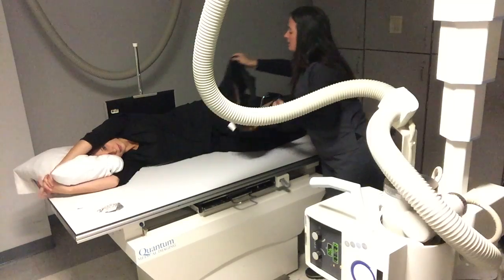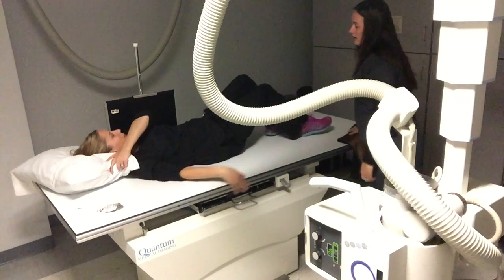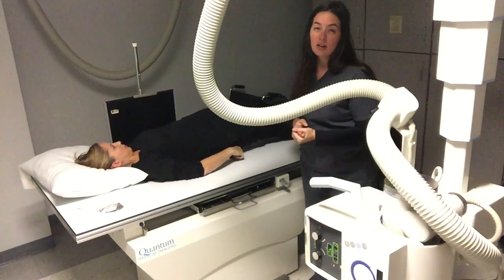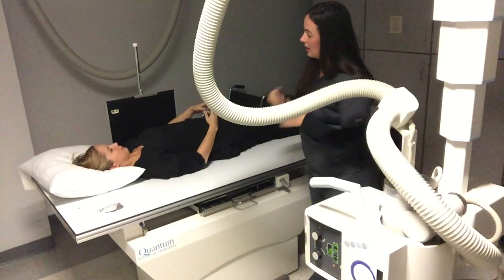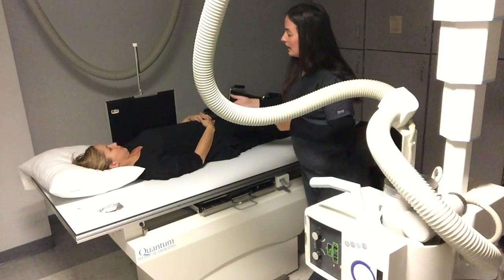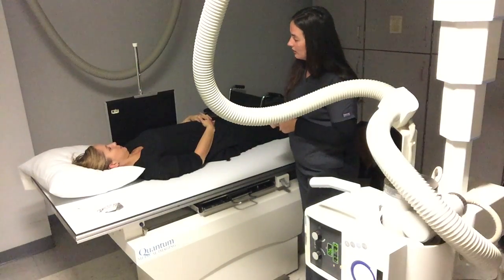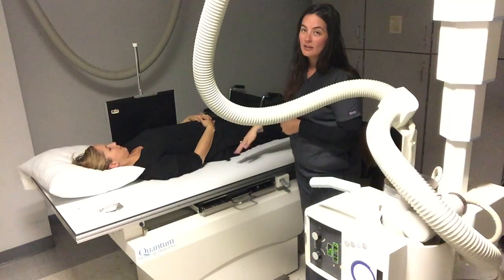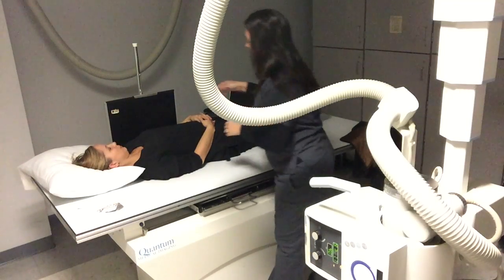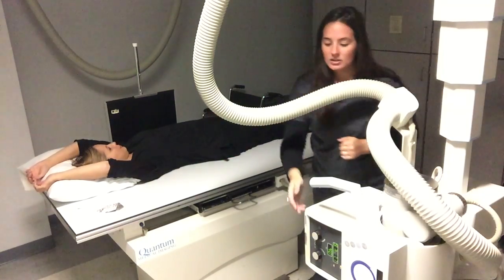Now the other projection we're demonstrating is the cross-table lateral — some people also call it a dorsal decubitus. This is essentially the same lateral chest you've done at wall Bucky, but now done with the patient laying down. Again, we would want that pad underneath the patient to elevate them off the table so we don't clip the back of them, since our cassette can't go any lower than the table height.